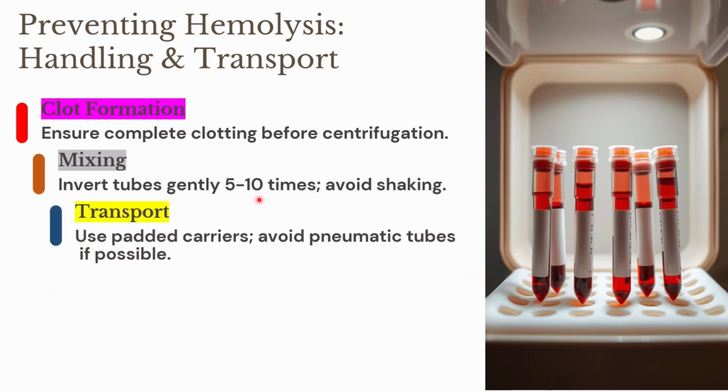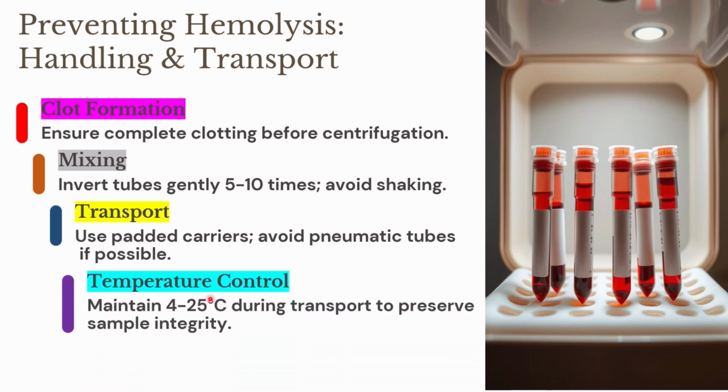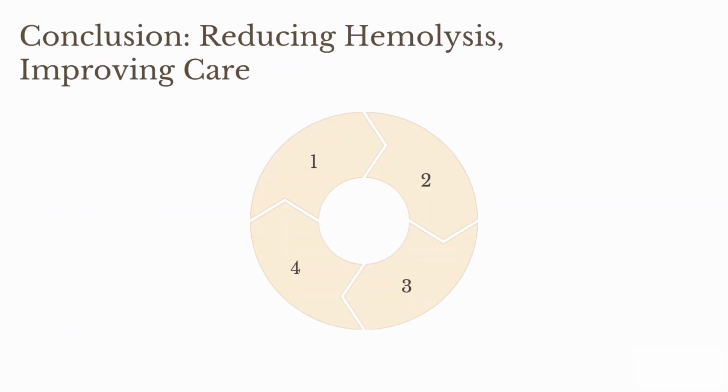Then transport. While transporting, we should always avoid the pneumatic tubes if possible, because these pneumatic tubes function on pressure or vacuum technology which creates a pressure on the tubes which can lead to hemolysis. And proper temperature control during the transport is also important to preserve the integrity of the sample.